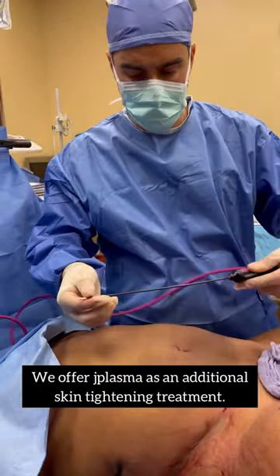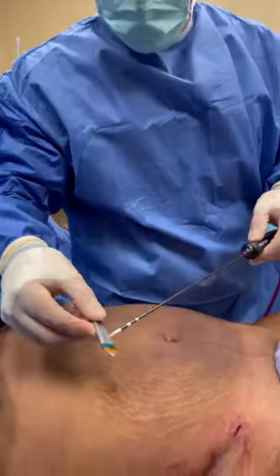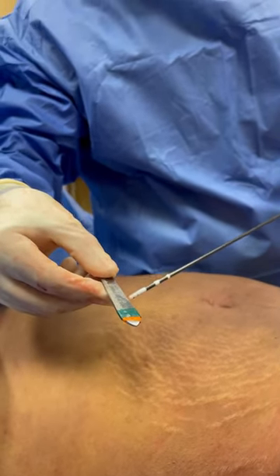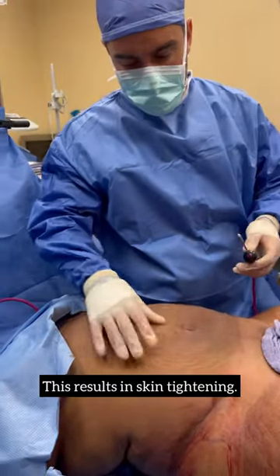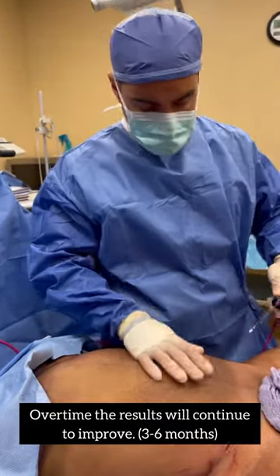J-plasma essentially looks like this — the tip delivers radiofrequency energy. Between the tissue and this probe, radiofrequency is delivered, which results in tightening of all the connective tissue septi that are responsible for this loose skin. The hope is that over time, over the next three to six months, the skin is going to tighten itself up.